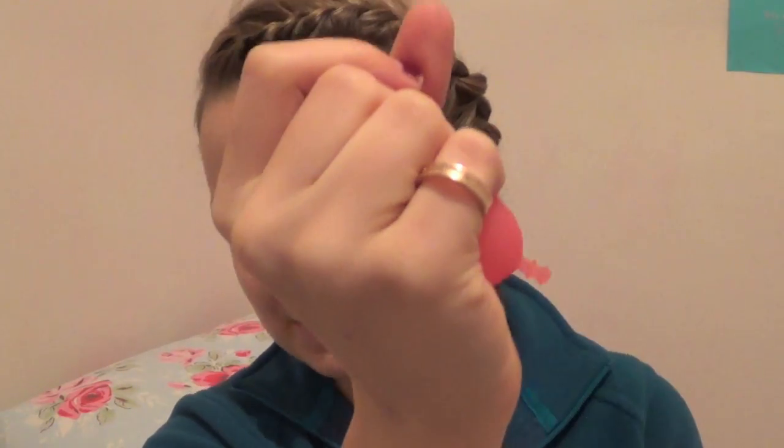People often ask, this is not so much to do with why your cup leaks, but why you can't feel it. Should you be able to feel it if it's open properly? No, you shouldn't be able to feel it actually if it's open properly, because everything of the cup should be inside your vaginal walls. There should not be any stem sticking out. It should all be inside your vagina.